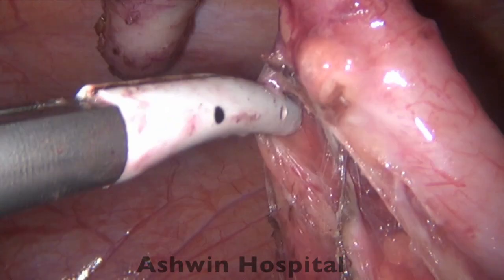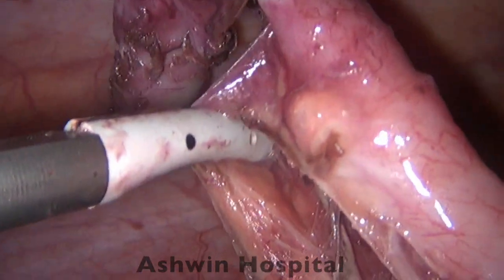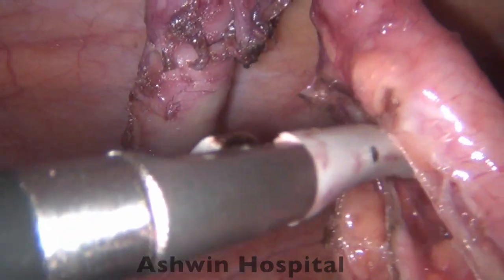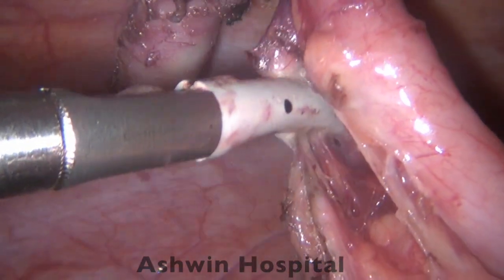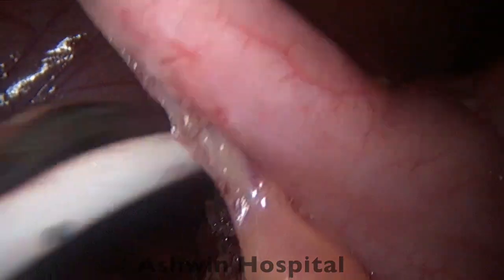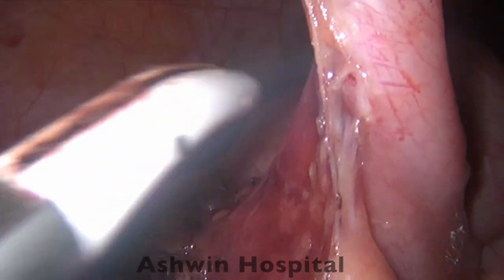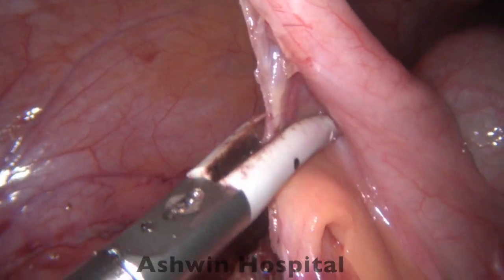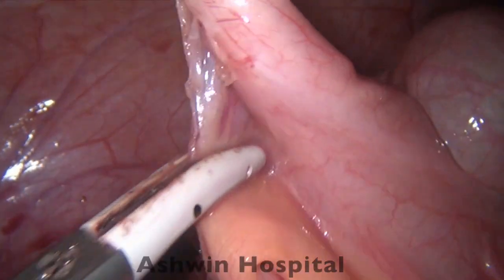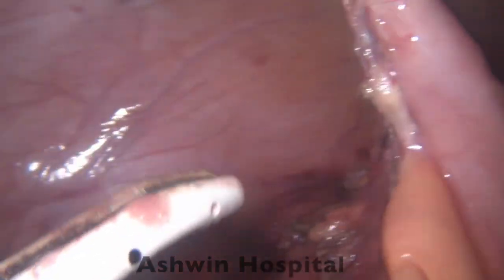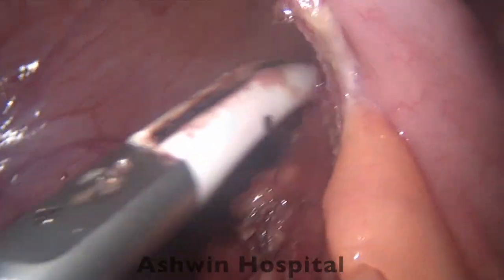Flipping the camera laterally, structures away from the cecum present no major concern. A nice window is visible, and we use the cautery to perform thorough adhesiolysis all around so the appendix will be totally free and an endo loop can be applied without concern. The appendix and the coning of the cecum are now visible. We identify the cecum wall, hold the tissues, pull them away from the wall, and use only sophisticated energy or bipolar — no monopolar at this level.